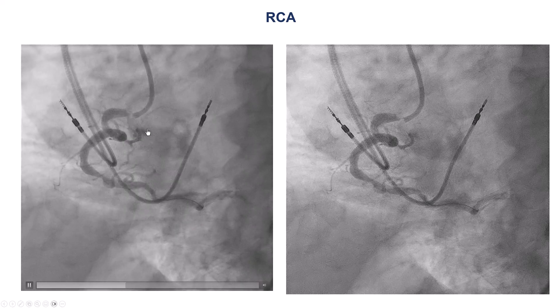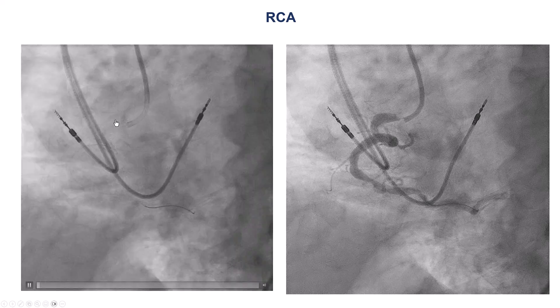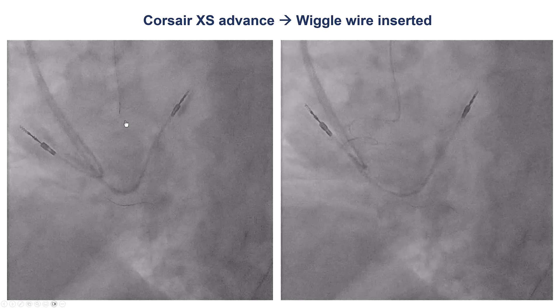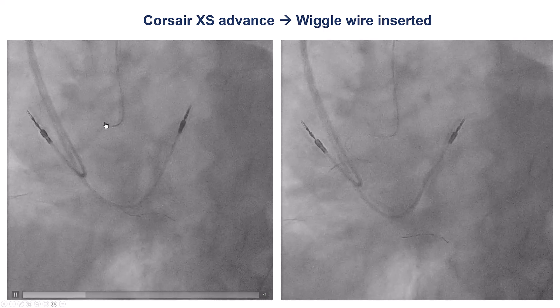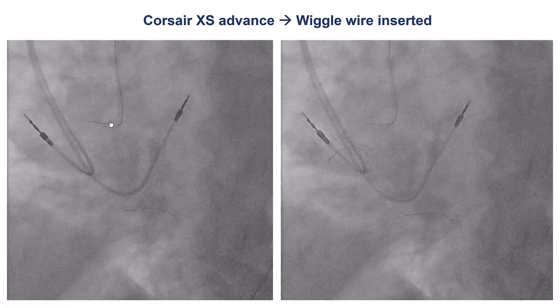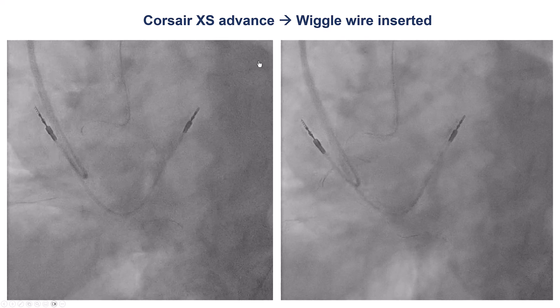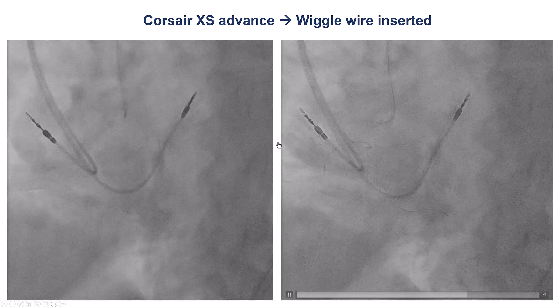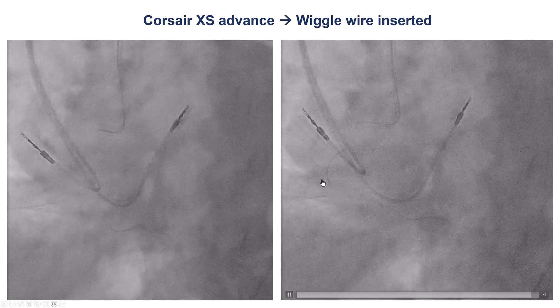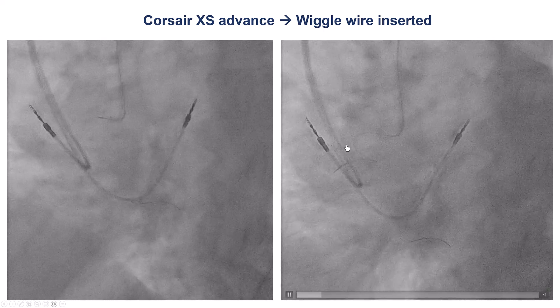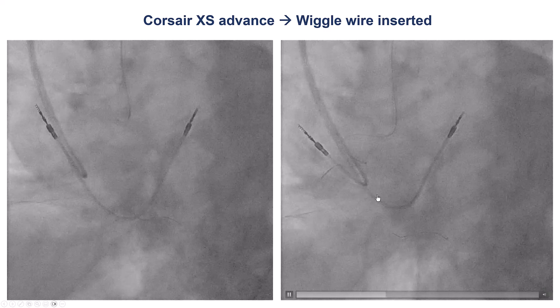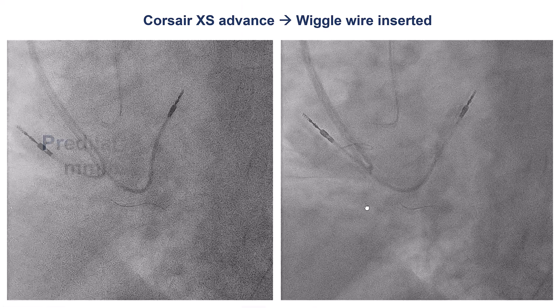After doing this, we were able to visualize the right coronary artery better, and indeed there is a very high-grade ostial stenosis. The polymer-jacketed Sion Black wire did not provide very good support, so we wanted to exchange it for a more supportive guide wire. To do that, we used a Corsair microcatheter, which was advanced as far down as we could into the vessel. We can see the severe tortuosity of the right coronary artery. We then removed the Sion Black and inserted a wiggle wire, which has a wavy pattern that provides very good anchoring and support for the guide catheter.